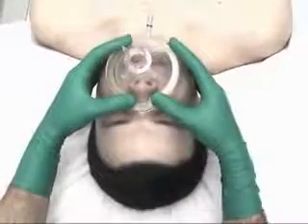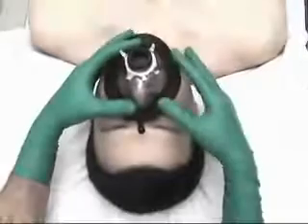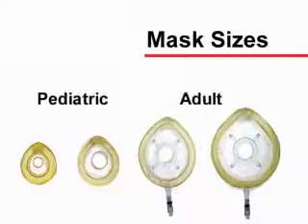device. To maintain a good seal, it is imperative for the mask size and shape to conform to the facial anatomy. This is particularly important in the pediatric population. Thus, several mask shapes and sizes should be readily available.